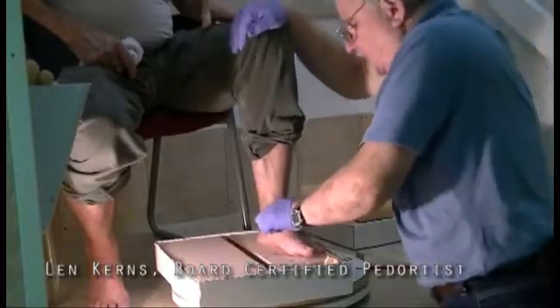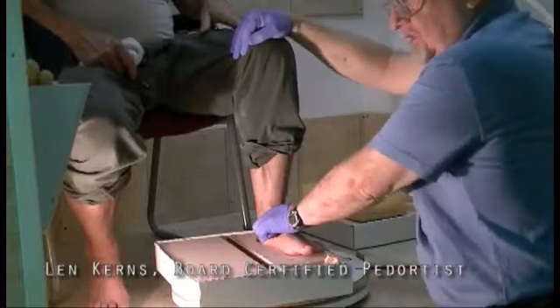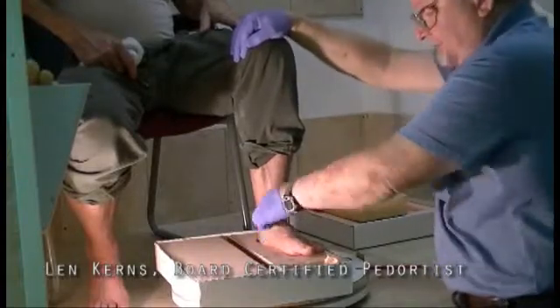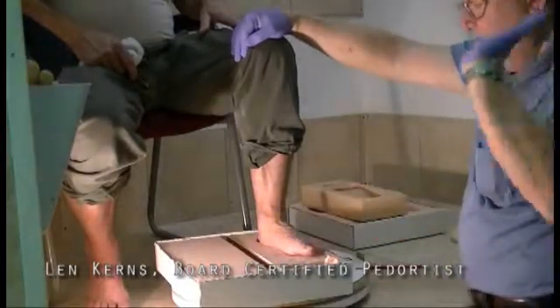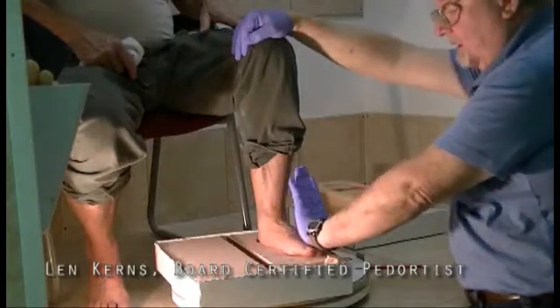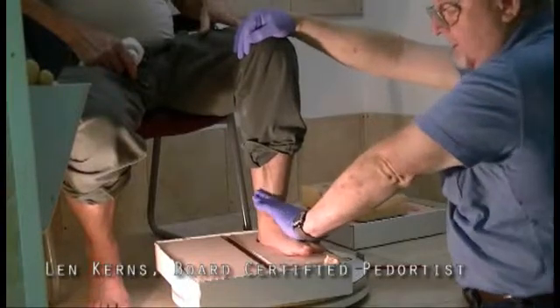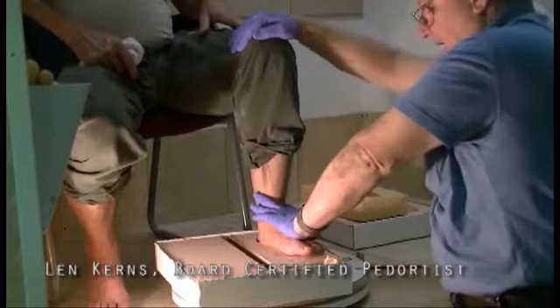So with both hands, I'm just going to push it down very lightly till I feel the bottom. Not trying to flatten the heel out, but I can just relatively feel the bottom. And the forefoot is staying the same. And with the palm of my hand, I'm going to place the palm of my hand not on the toes and not on the instep, but on the metatarsal heads. How's that shot? Good. Okay.